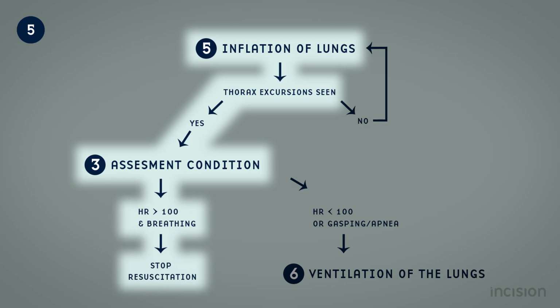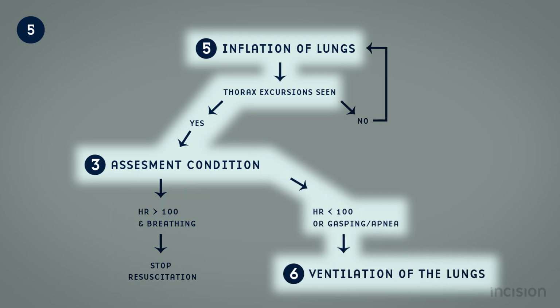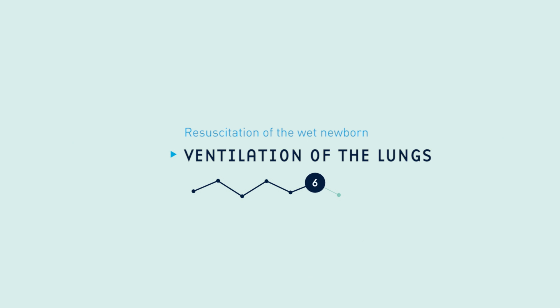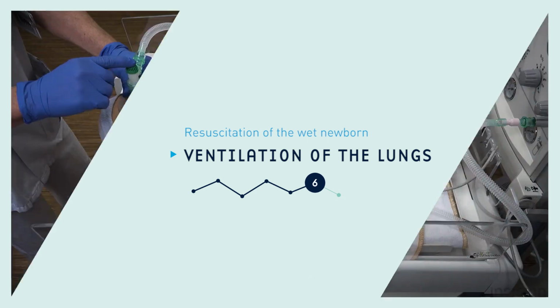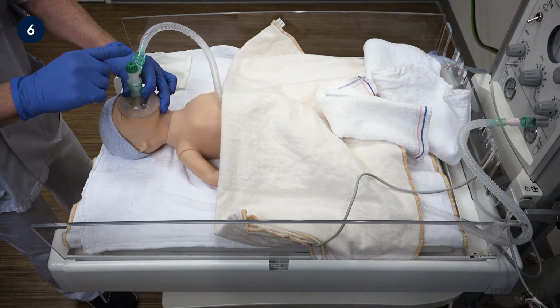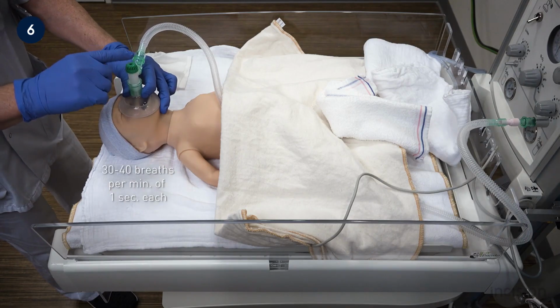If the heart rate is over 100 bpm, with adequate neonatal respiration, then resuscitation is stopped. If the heart rate is below 100 bpm and thoracic movements have been seen, the next step is ventilation of the lungs. This is shown in step 6. After inflating the lungs, it is advised to continue ventilating at a rate of 30 to 40 breaths per minute for 1 second each.